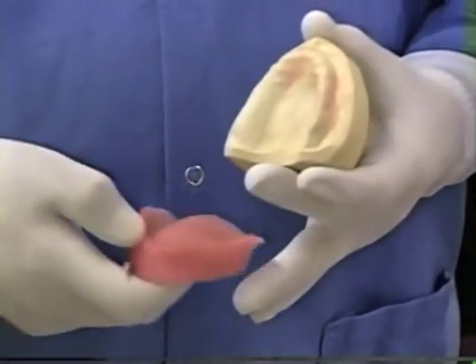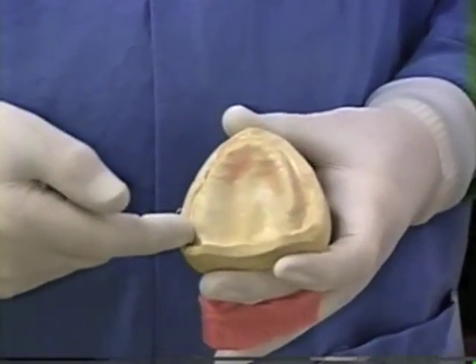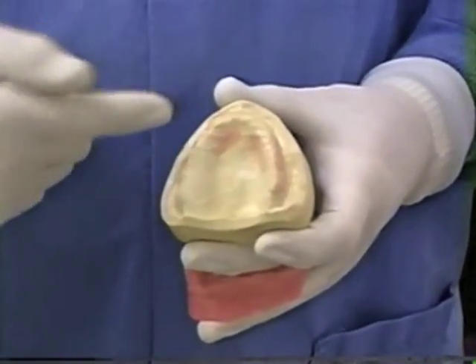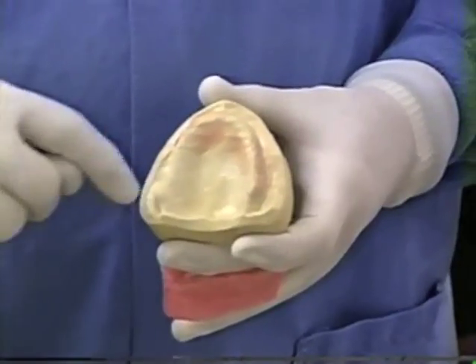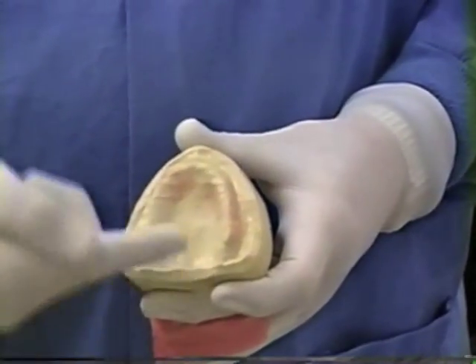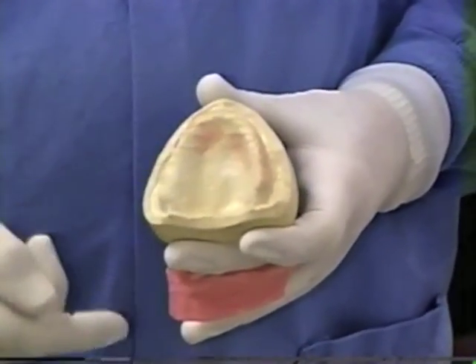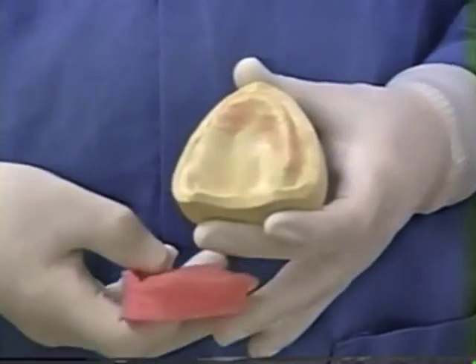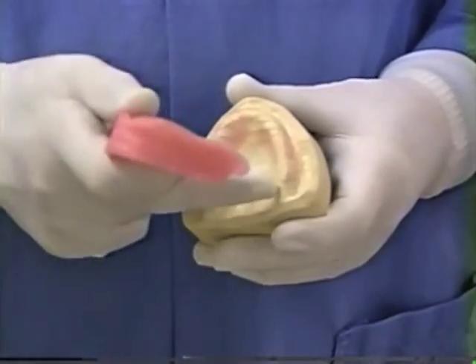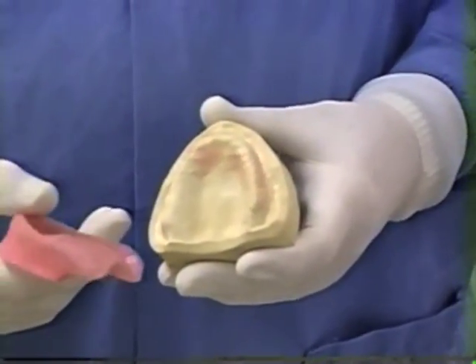We need to do the posterior palatal seal. The posterior palatal seal is that part of the peripheral seal of the denture that connects the peripheral roll of the maxillary all the way around. It connects across the palate where we don't have a seal other than by displacing some tissue. We're going to establish the length of the maxillary denture and carve into this cast a posterior palatal seal.